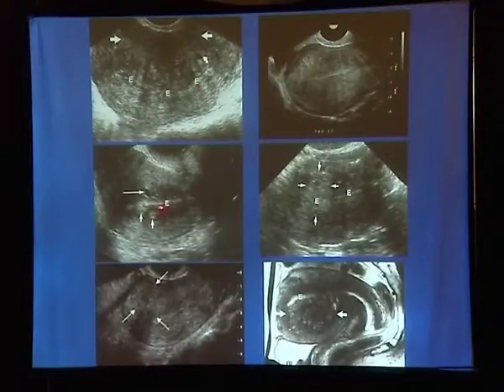And these are the small ill-defined nodular lesions and the cysts which we see in the junctional zone here. This is characteristic of adenomyosis. This is also another adenomyotic patch which has gone into the subendometrial myometrium here. So, an ill-defined nodular lesion, not so well defined like a fibroid.